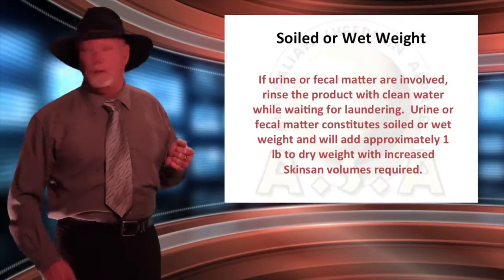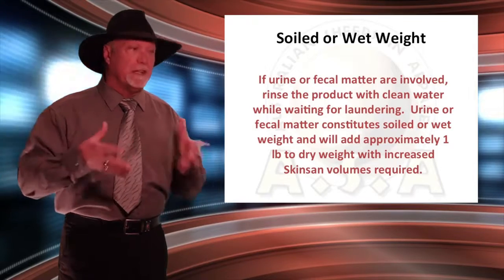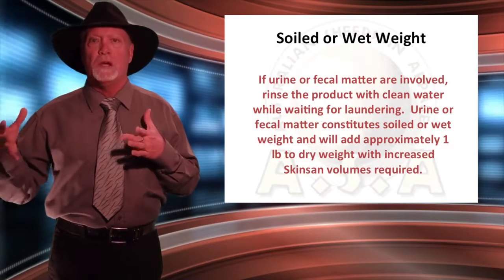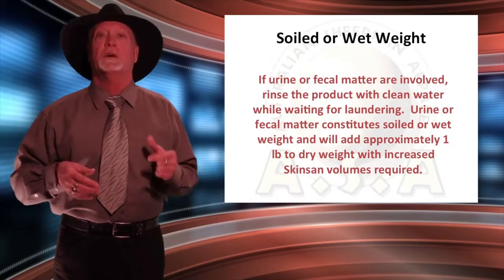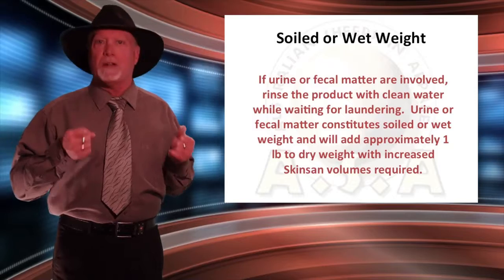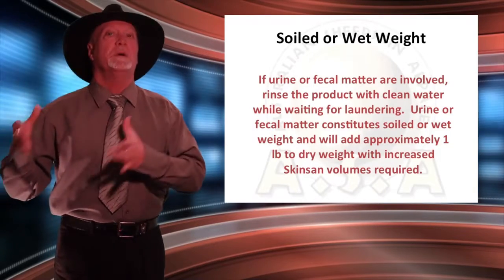Now, continuing on from there, we'll look at soiled or wet weight in the product. That is when we have urine or fecal matter that gets into the sheepskin. Someone has an accident and we get soiled or wet weight into the product. If the product is going to be sitting for a while without going to laundry, you need to rinse it out. Get some fresh water and rinse the urine or fecal matter out of the product, because once it goes off or ammoniates, it then becomes very deleterious, or very detrimental, to the sheepskin. It actually can chew holes and so on in it. So we need to rinse the product if it's going to be left a little while prior to going to laundry.